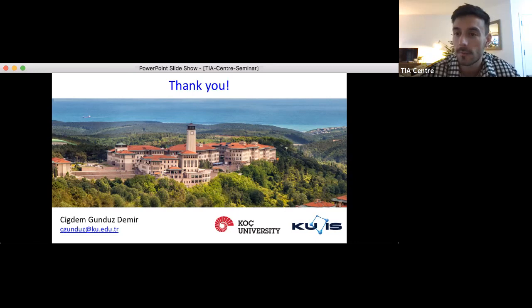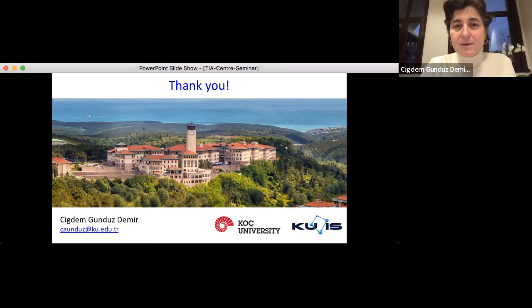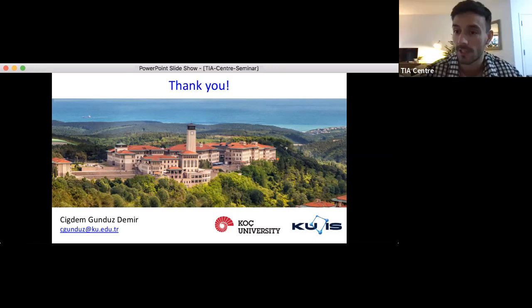So we developed an approach a few years ago where we were working with limited data. I think our data set was only comprising of around 30 images, 30 very small visual fields. And we developed a nuclear segmentation model, and there was a loss function we created that was sensitive to the hematoxylin content. And we found that it worked especially well when we were presented with that limited data set. So maybe that's the sort of finding that you've also found.